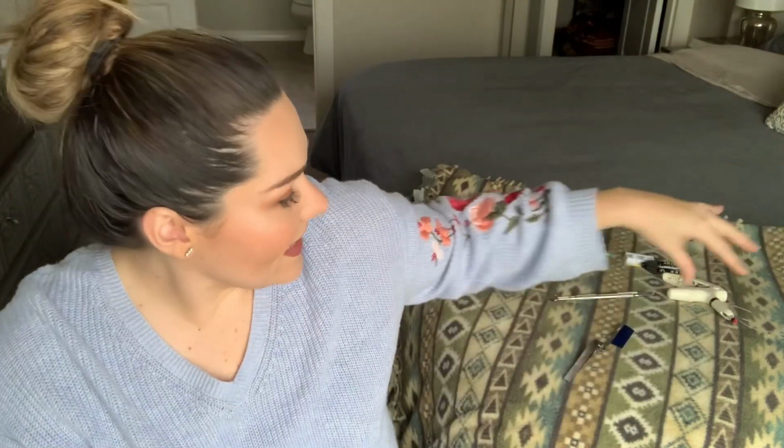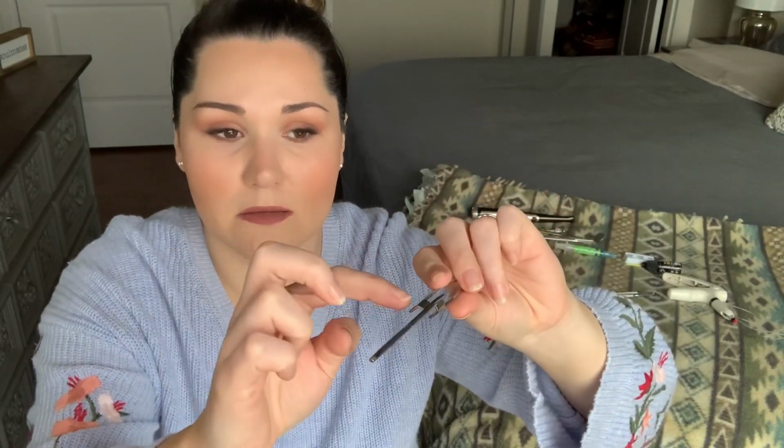He's gonna floss to make sure you can get the floss in between and that the contact is tight. And then you are gonna hand him this guy. So this is your bite paper. So basically you're gonna hand it to the dentist. Again, you wanna hand him the handle part of it. And the patient is gonna bite on this occlusal paper, and it's gonna mark any high spots of the filling in blue. And then he can do his adjustments if needed.